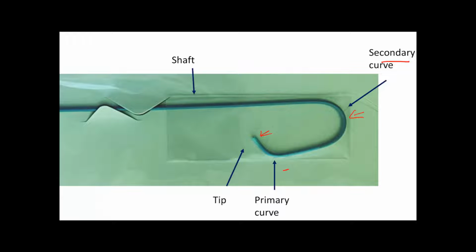This curve is designed for definitive purposes. It will be different for a catheter meant for intubation into a left coronary artery, from what is meant for a right coronary artery, or what you need for an SVG graft or internal mammary artery. There are differences in shapes for definitive purposes. We will discuss that.